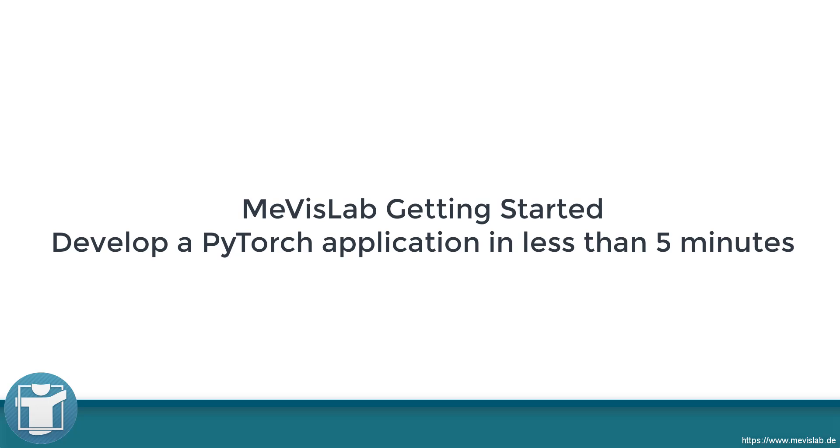In this video, we are developing a simple MevisLab application applying a pre-trained PyTorch ResNet AI model in less than 5 minutes.